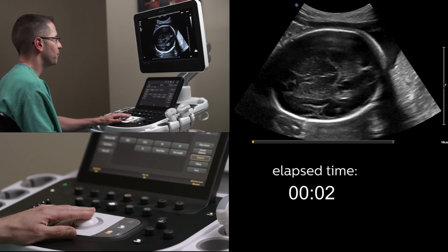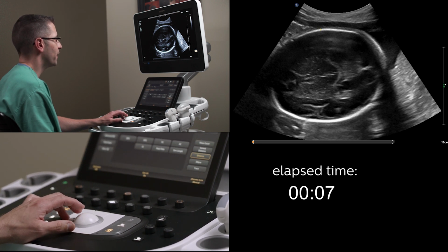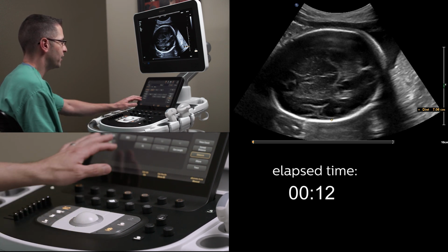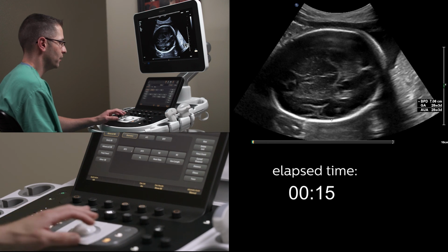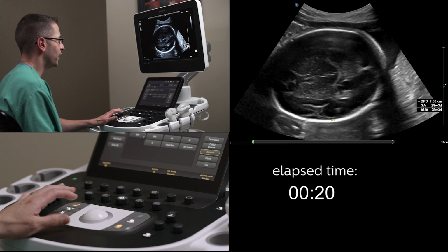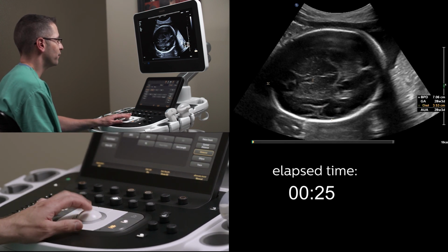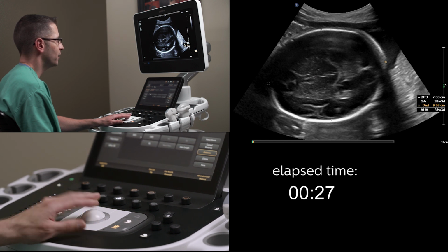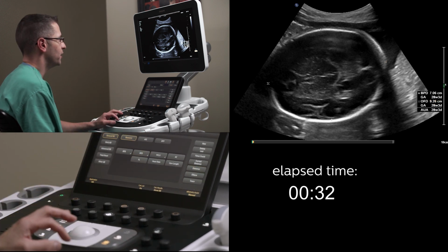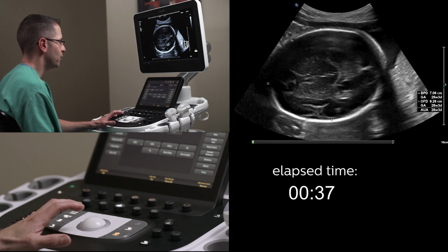So again, click measure, maneuver the calipers to the upper portion of the biparietal diameter and move it down to the inner portion of the biparietal diameter, and then select the biparietal diameter and then hit acquire. Next, we will have to click measure again, bringing up another caliper, select the front portion of the head for the occipital frontal diameter, the back portion of the head for the occipital frontal diameter, accept those measurements as the OFD, and then acquire. So using the trackball and having to do this.